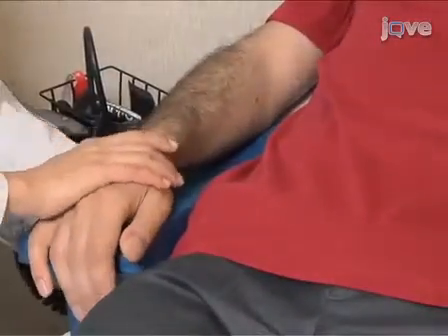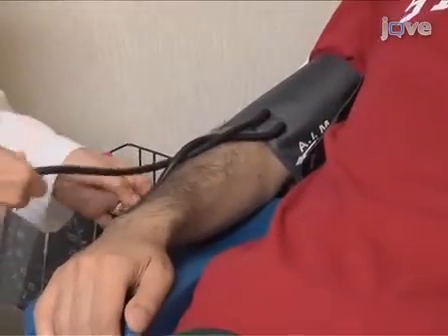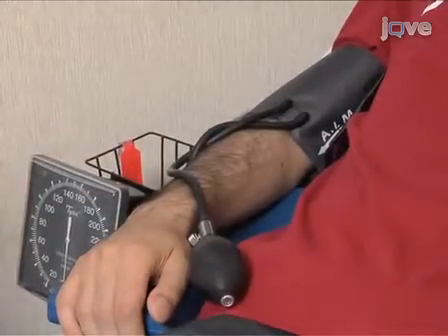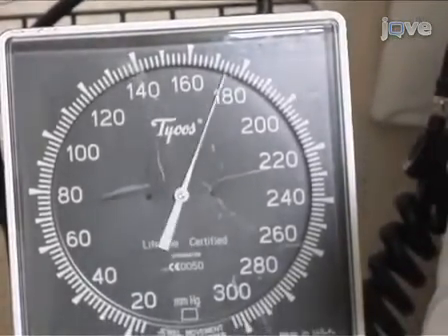Apply a blood pressure cuff to the arm and allow the arm to be supported at the patient's side. To allow the patient to reach cardiovascular steady state, they should be relaxed and comfortable in the supine position for at least 15 minutes. Measure the blood pressure in the arm that is not occluded during the EndoPAT study.